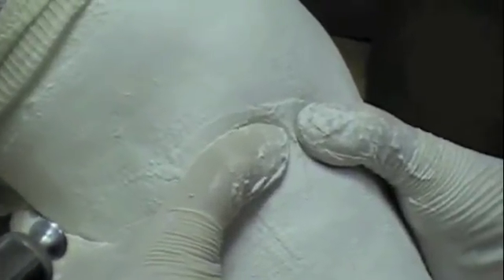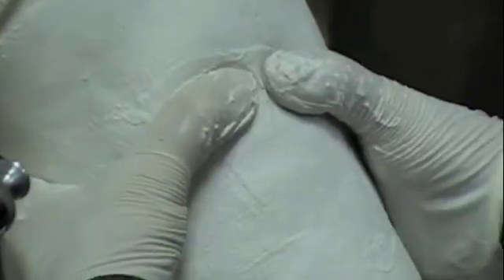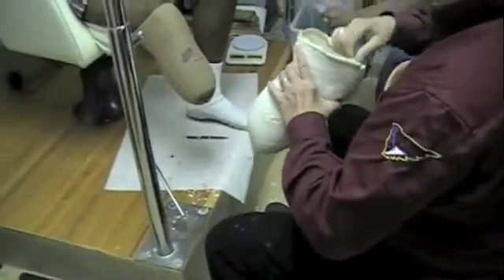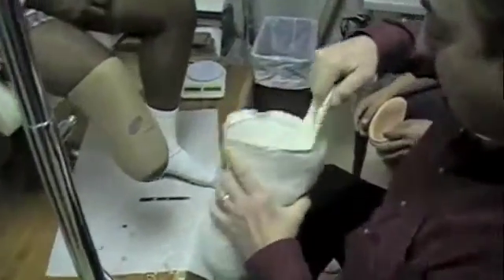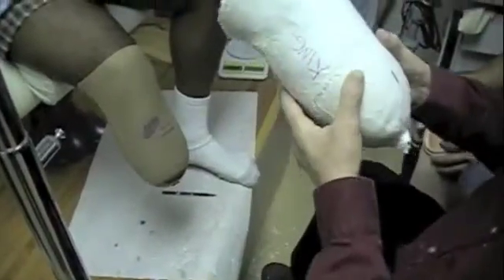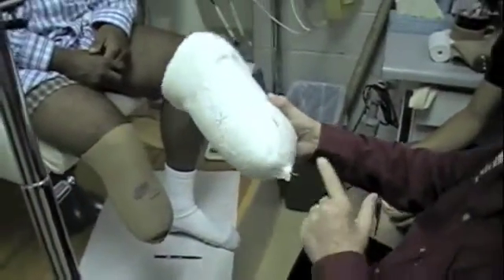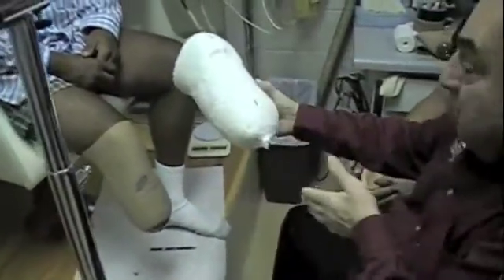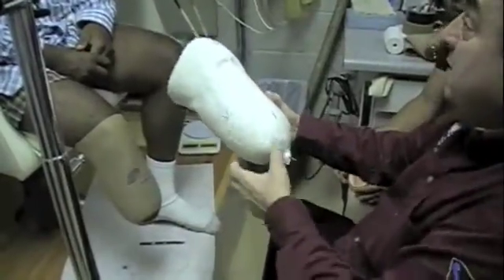A lot of your weight's going to be taken here. Basically, you're going to distribute the weight forces between probably 60–70% at the knee and the rest by compressing all the way around. Now we've got your impressions — that's the model. I'm going to remove this now. I'm going to remove this knot because that's going to give us a port in the alignment where we want, and that's going to help us to align the socket. That's going to tell us where I want to put the model for the alignment of the tube that's going to be underneath you.